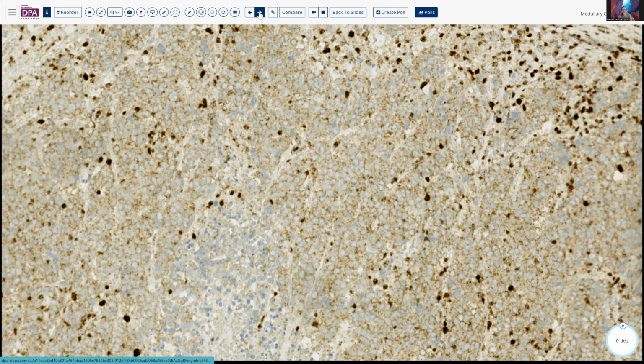And you may ask, well, these are older patients. Is this a germline or whatever? It can be both ways. But this is certainly a very common finding that these are mismatch repair deficient tumors.